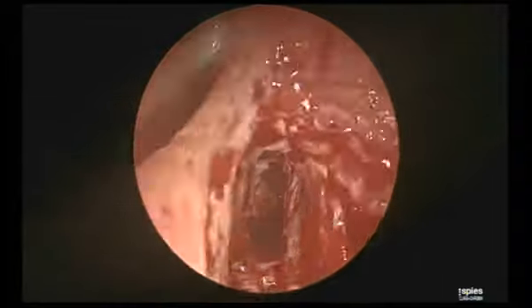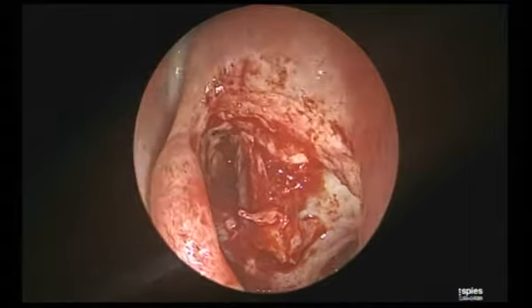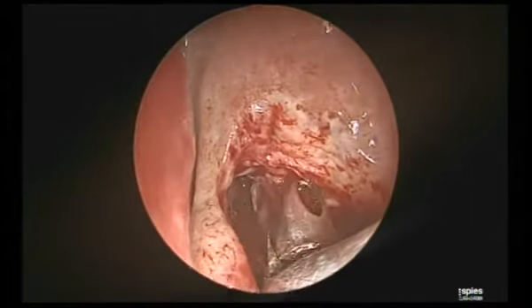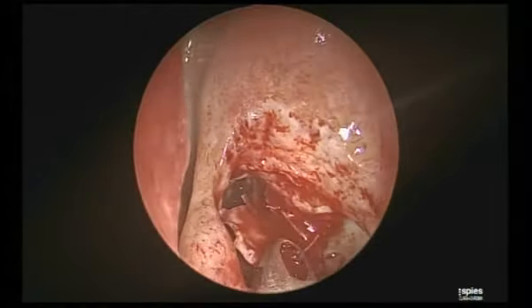Fantastic, and that is the interfrontal cell anterior to the... We'll see later. I have to take that into consideration. Sorry, I'm just trying to appear intelligent here. You are. Don't say that you are not.